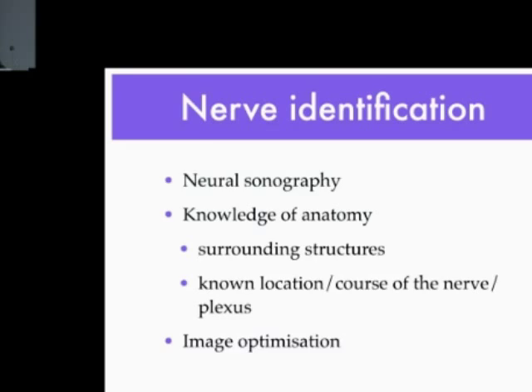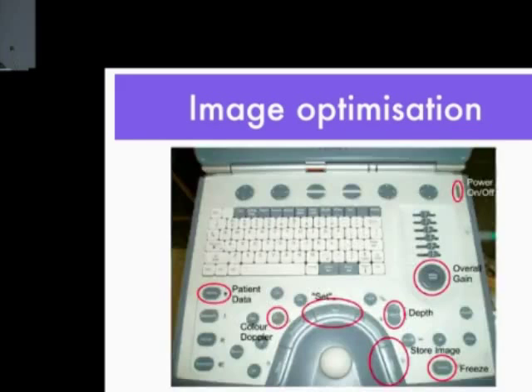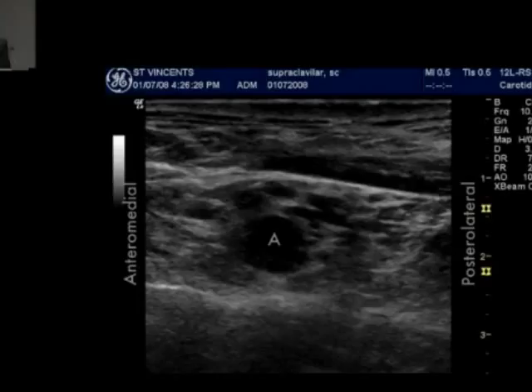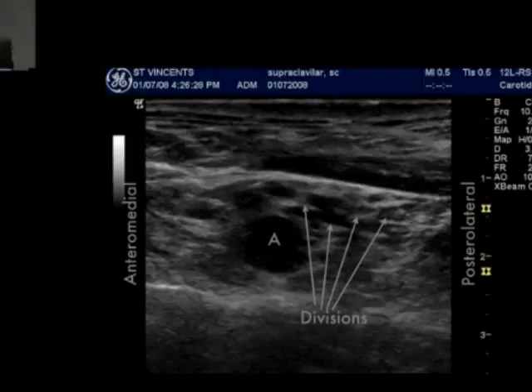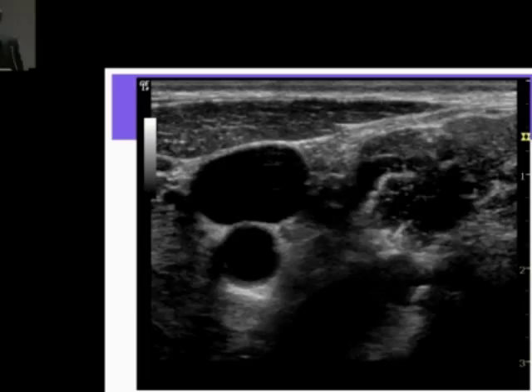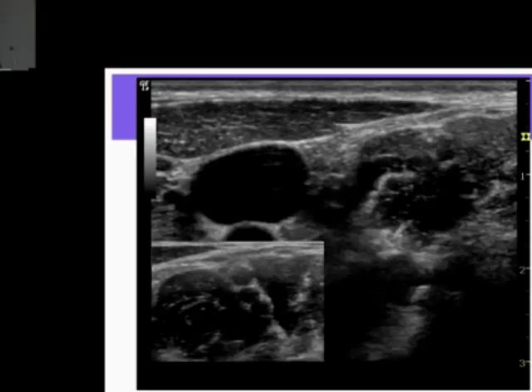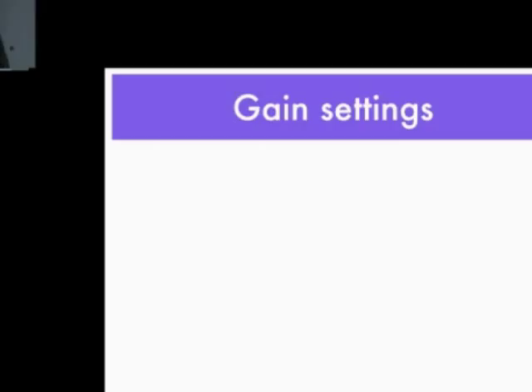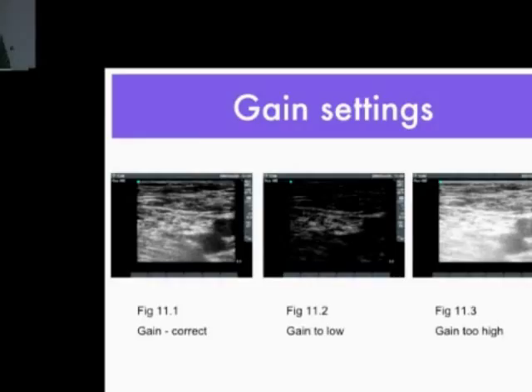Image optimization in more detail: a very common mistake trainees make is setting the depth too great for a superficial structure. As soon as we reduce the depth, target structures become more obvious and neural structures are much clearer. Always go back to basics and check your depth. Another example is the trunks of the brachial plexus — difficult to see in the larger picture, but as soon as we zoom in, the trunks are much clearer. Another basic setting trainees forget is the gain: too much gain means all signals are coded as white and you can't see any structures.